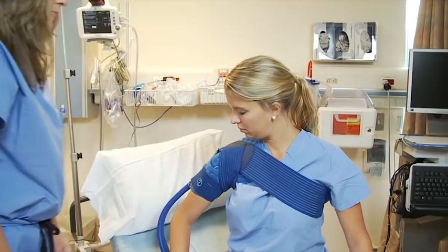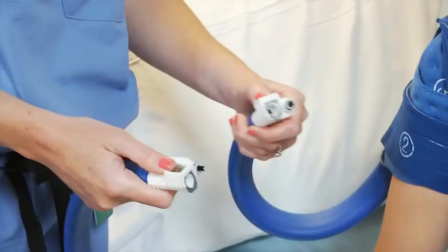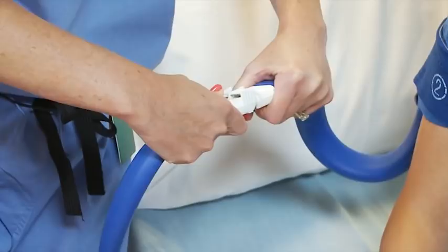Now you're all padded up. Now we're going to connect the blue hose to the other end of the pad. In order to do so, you want to make sure you depress the metal clips down and then you put them in opposites. They go in and you firmly push and you'll hear the click. Now you know it's locked.